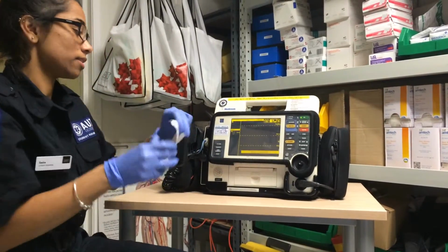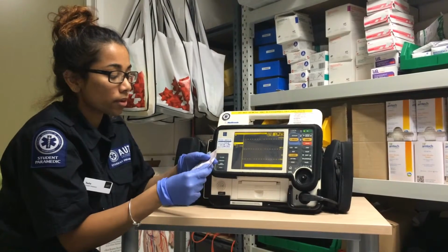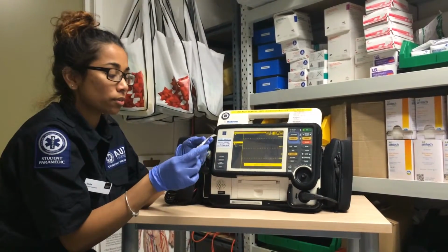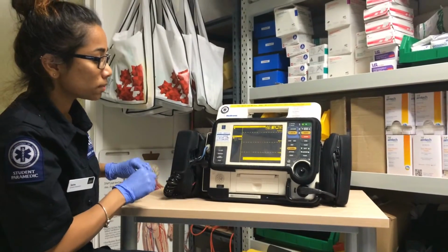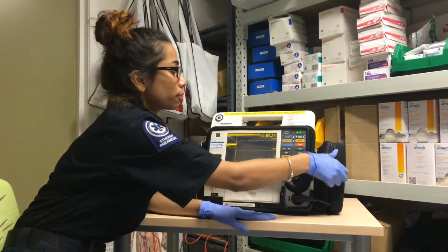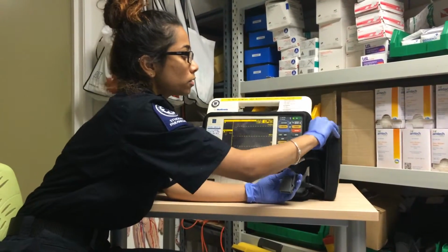So when you click the user test, it will print out this user test for you, and it will say the date and the time, and it will also say user test pass. So it does say user test pass, so the machine is good to use. So we also want to do a test defibrillation. The left hand side of the LifePak 12 is the defib side. So we want to attach our defib to a test load.